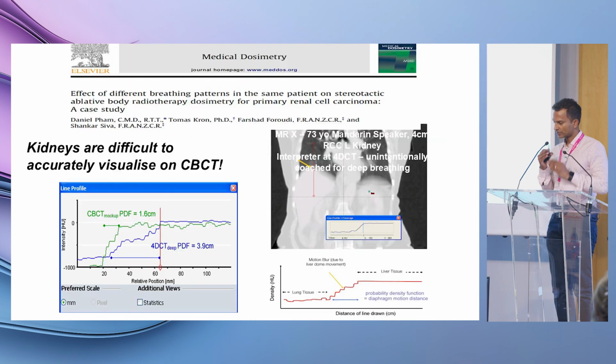This was useful because we can get a measurement of what the patient's breathing is. So at the mock-up, the green line there is what we see for the patient at the time of preparation for treatment. It's a 1.6 centimeter motion in the kidney based on measuring the kidney liver dome. And when this patient represented, they actually took a deep breath, which was not expected.